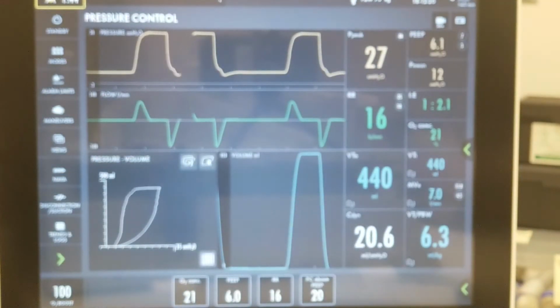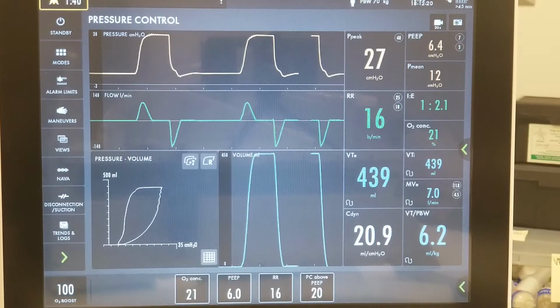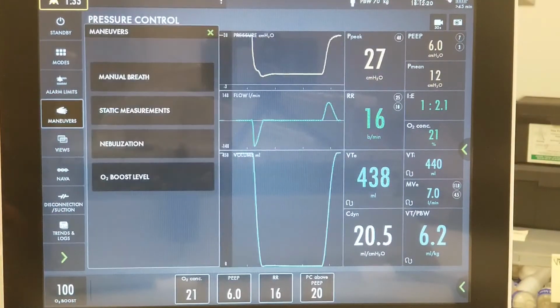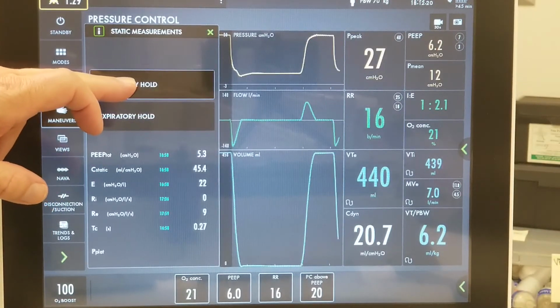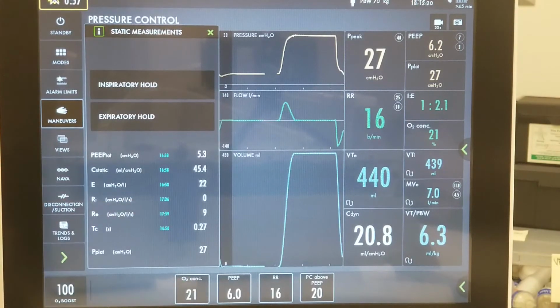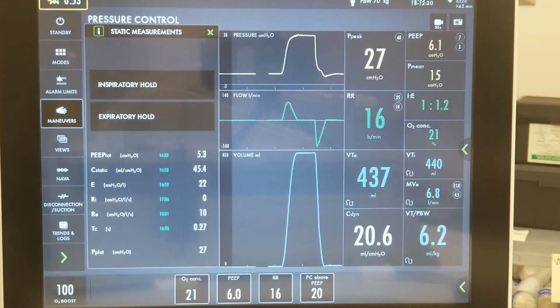So we'll just leave it here. We're only 10, 11 under. So that's good. And our peak pressures are still under 30, 35. So we're in a safe area. And notice there's this long period of no flow. So if we do an inspiratory maneuver, which is the inspiratory hold I'm talking about, we're going to find that our plateau equals peak again, PIP 27, peak 27.